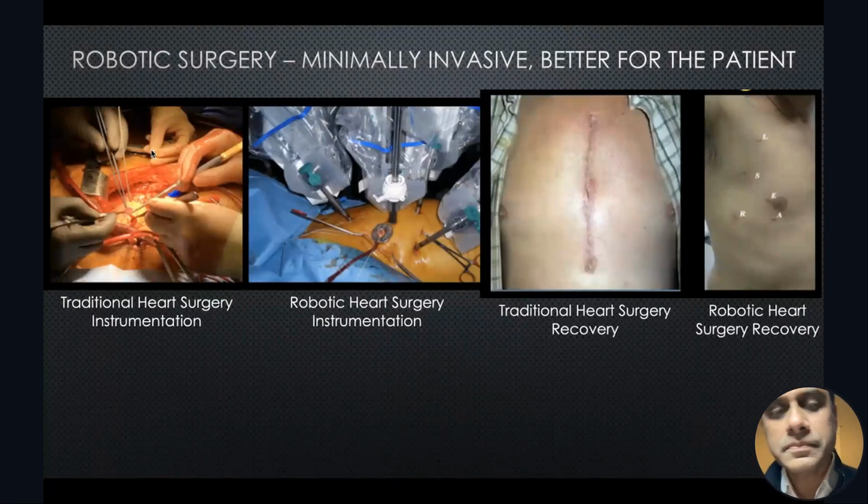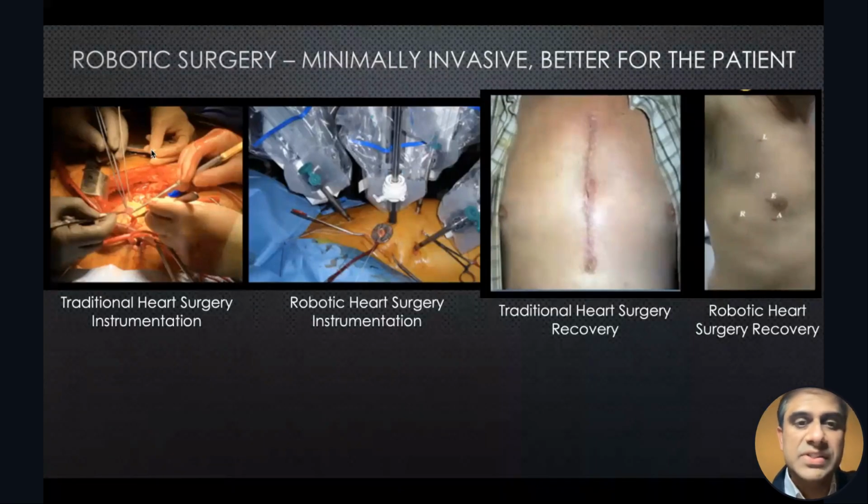This is the Da Vinci, which is one of the first medical robotic systems out there, and it's being run by the Intuitive Surgical company out of California. So you can see the impact it has already created in the field of surgery. So I guess at this point we should not stay behind, and as dentists, as dental surgeons, it's imperative that we show that yes, we in our field are equally advanced and are ready to embrace this kind of technology into our practices. Next slide, please.